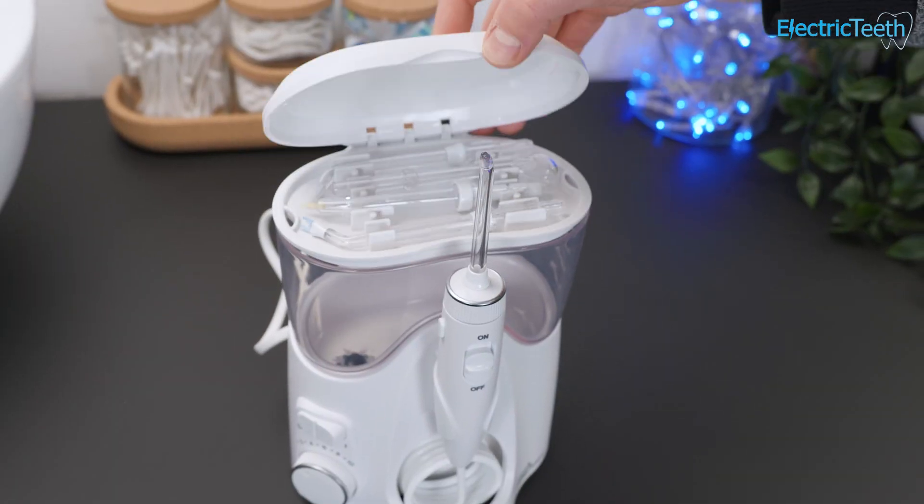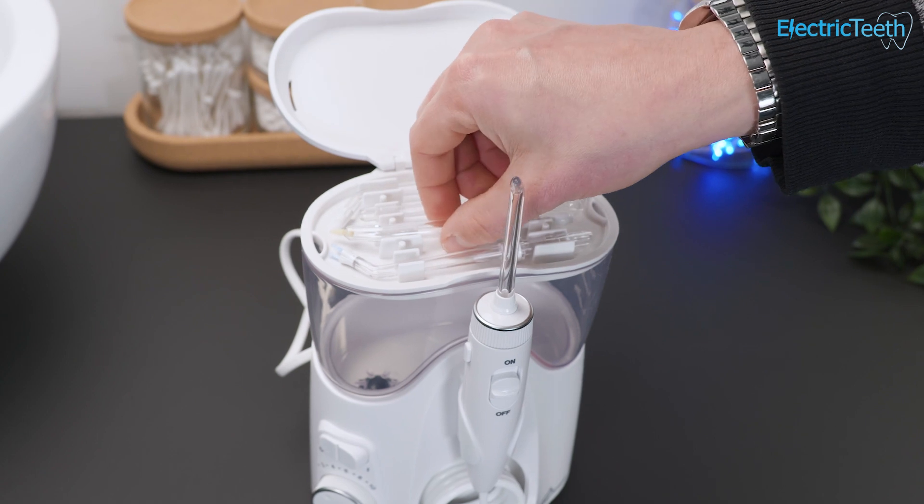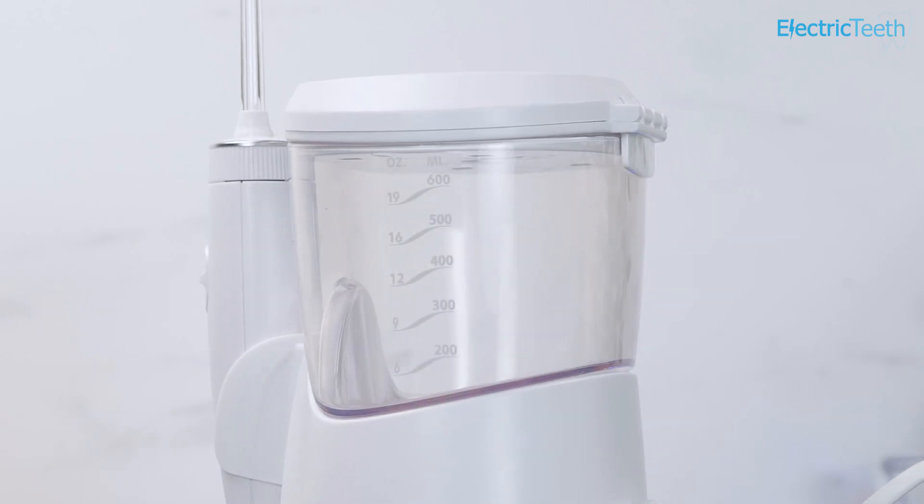You've got a storage unit for the nozzles that sits on top and actually acts as a lid, so it can protect dust and debris from getting in there. You also have markings on the side of the reservoir that show how much water remains.